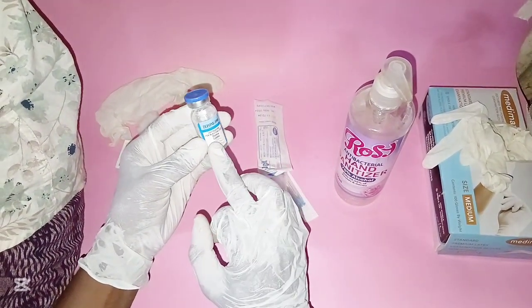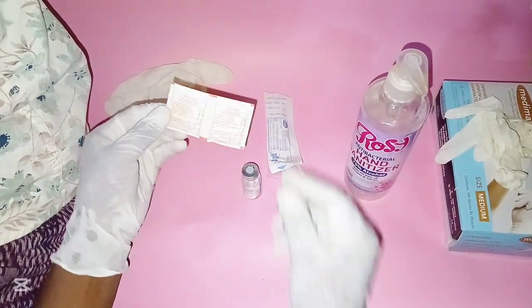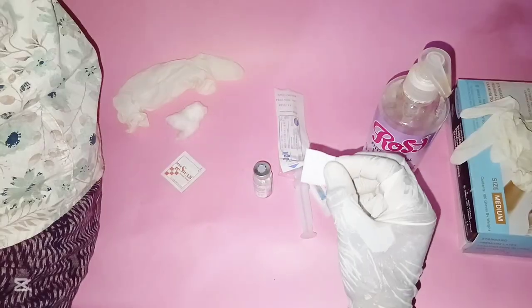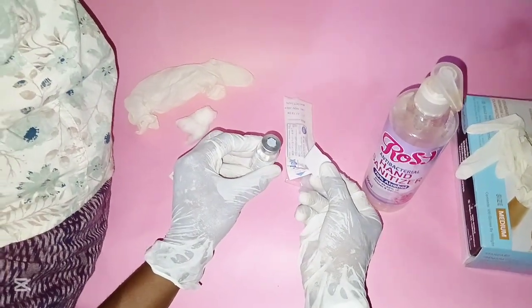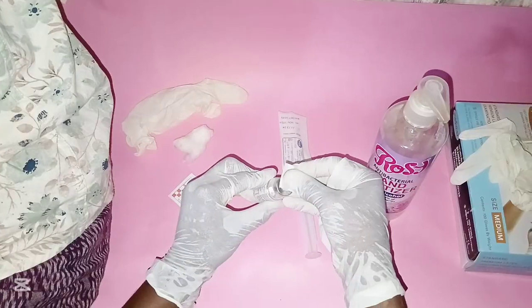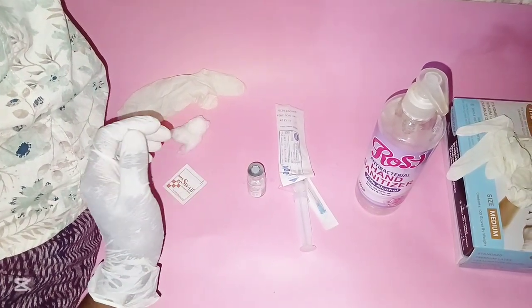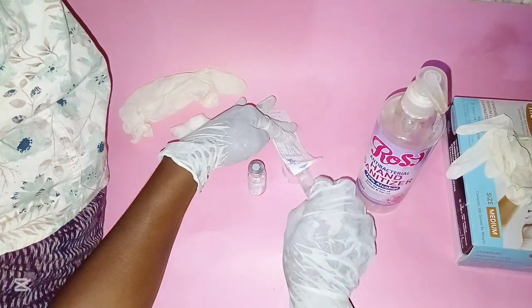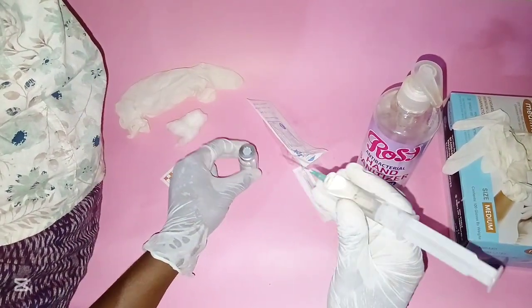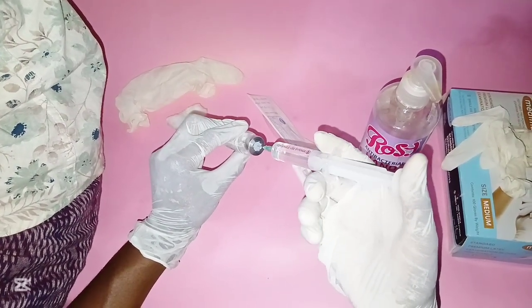Get the drug vial, flip off the cap and open it. Get an alcohol swab and clean the opening of the vial, then allow it to dry for a few seconds. Remove the cap of the needle and transfer the sterile water for injection into the vial.